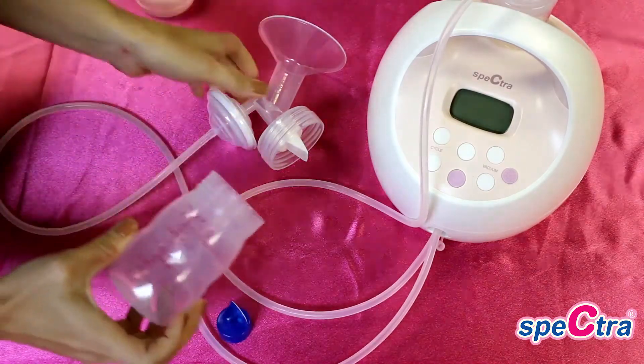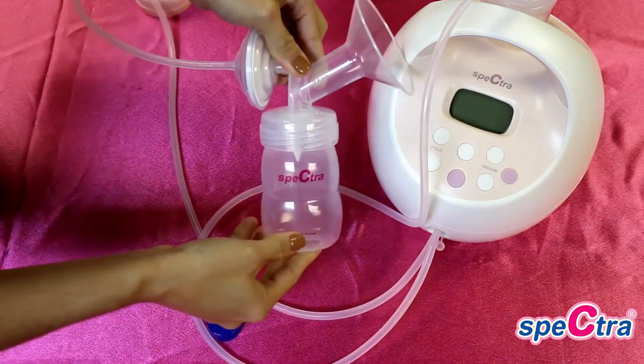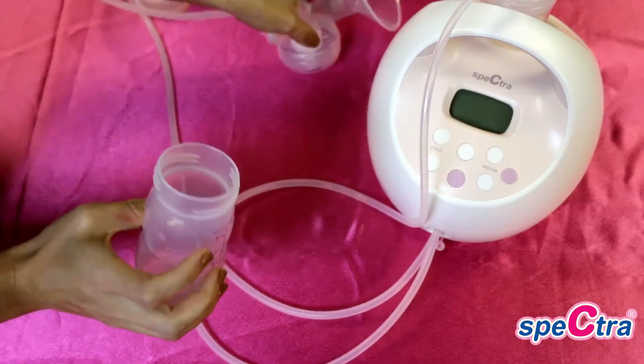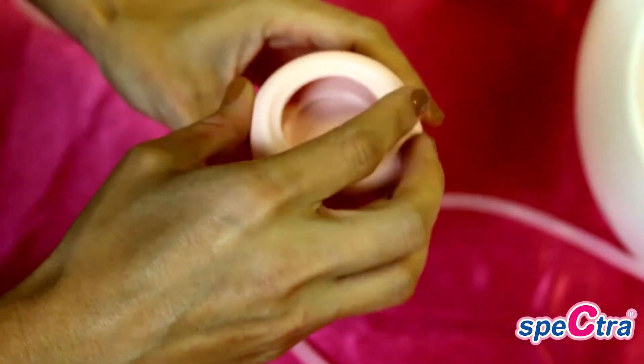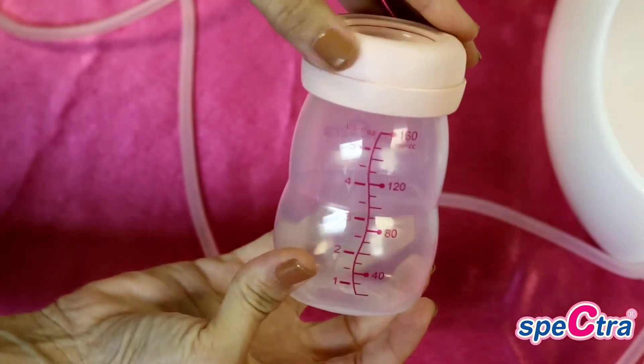You will next screw the bottle onto the bottom of the flange. The flanges and bottles are wide neck. After double pumping, you will unscrew the bottle from the flange and screw your cap and lid onto the pump and follow proper milk storage guidelines.